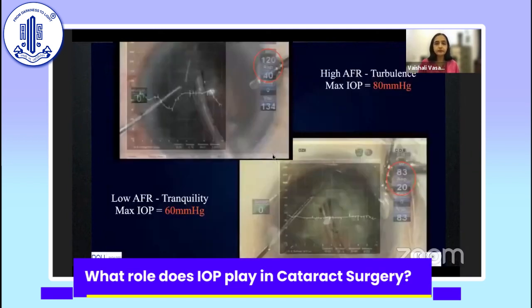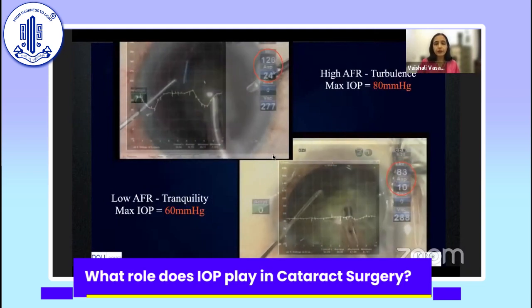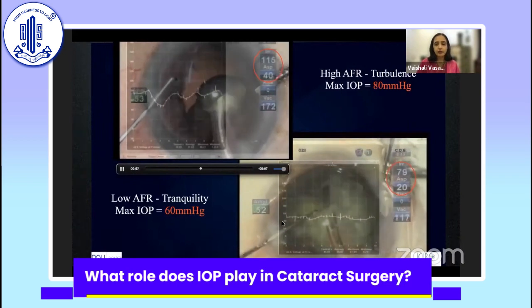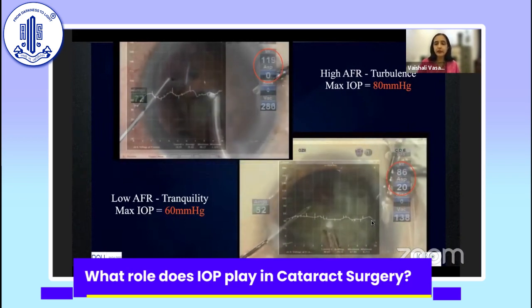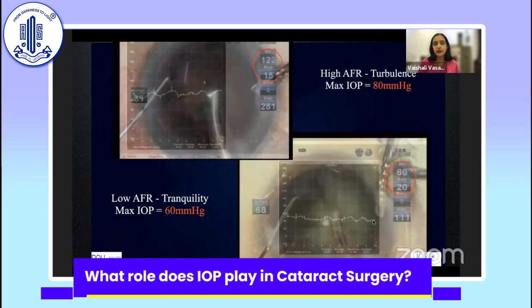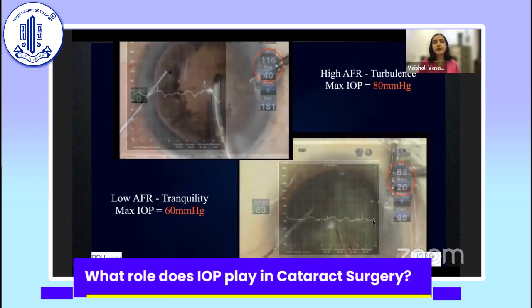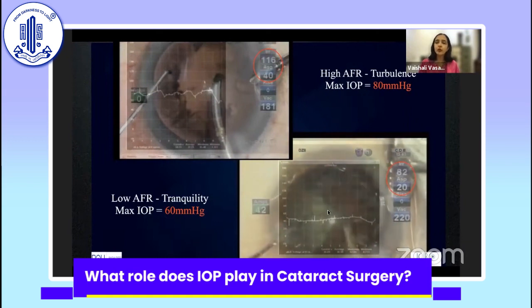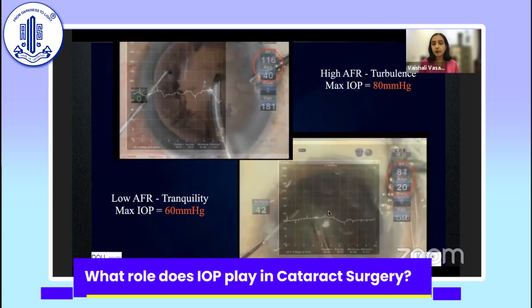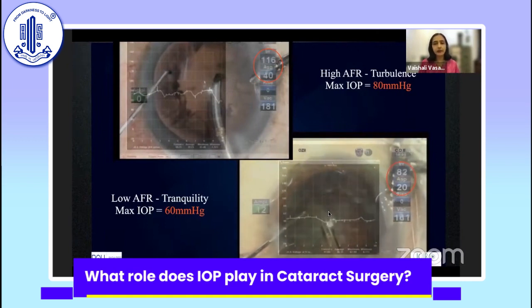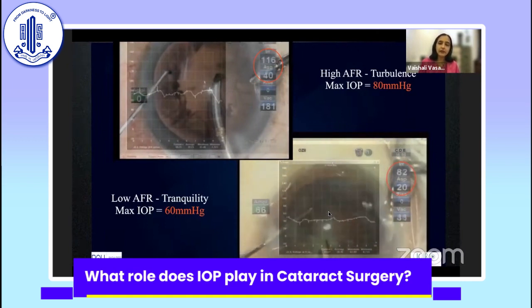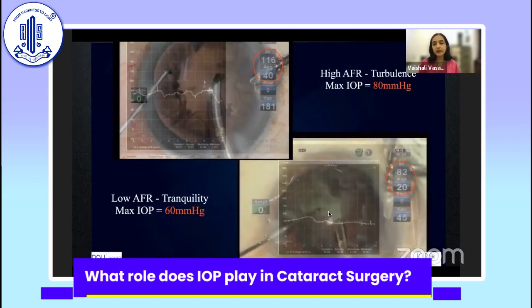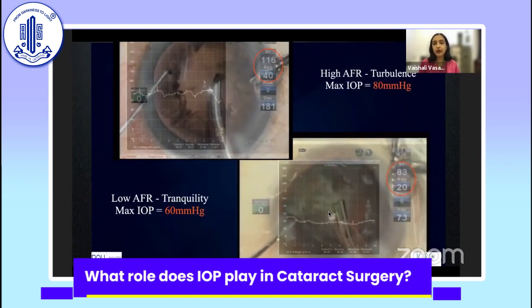To recap both videos together: at 40 cc/min with 110 cm bottle height there are far more IOP fluctuations, compared to 20 cc/min with a 70–80 cm bottle height which shows much more tranquility. It may take a few seconds more, but the surgery looks more controlled and the eye will be more forgiving on post-op day one and potentially in the long term, especially given the vascular events we are now seeing.